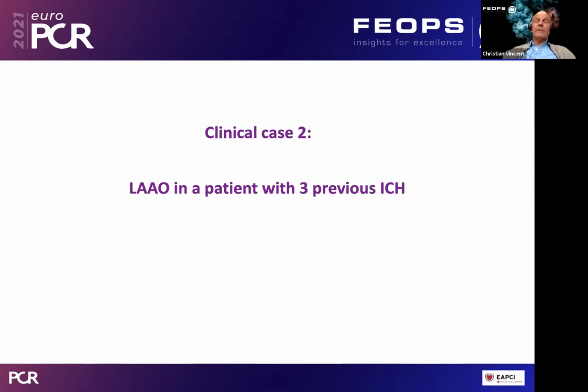And the very good news is that we were very actively listening to your comments, and not only you, because many other people made exactly the same comments, which makes a lot of sense. Of course, if you can reach easily the LAA from the transeptal puncture, the rest of the intervention is also probably easier.